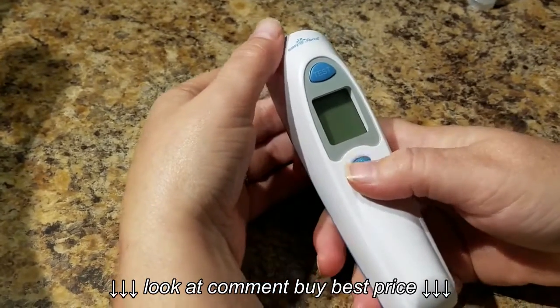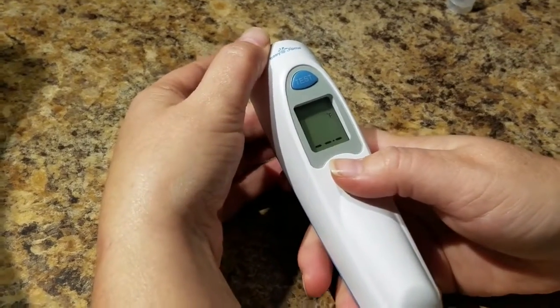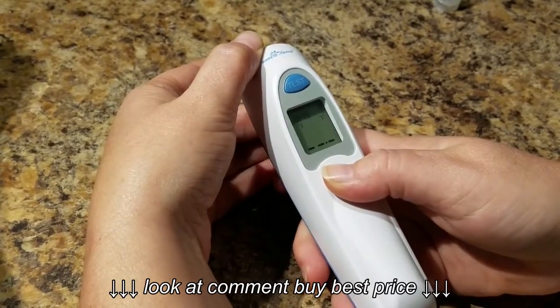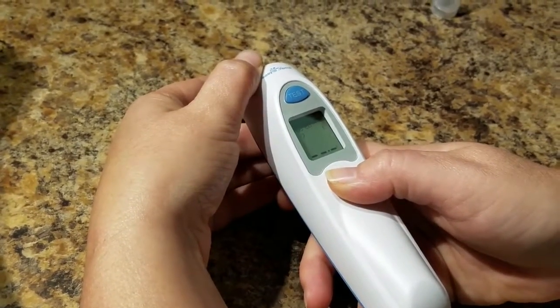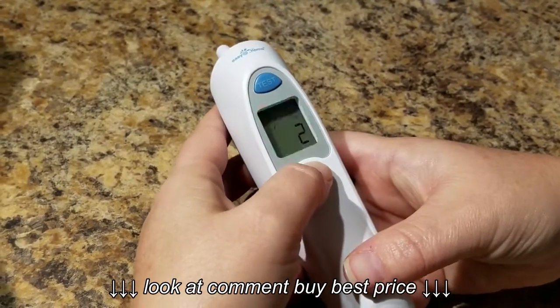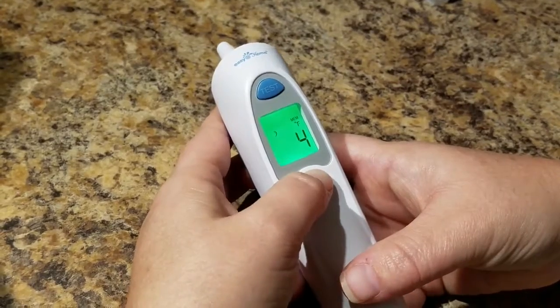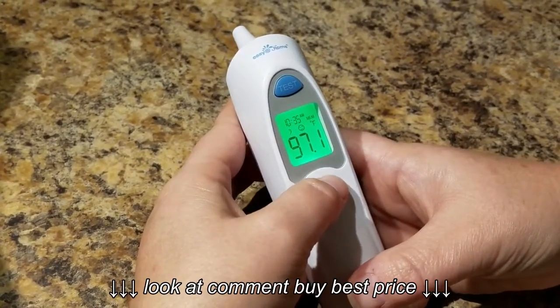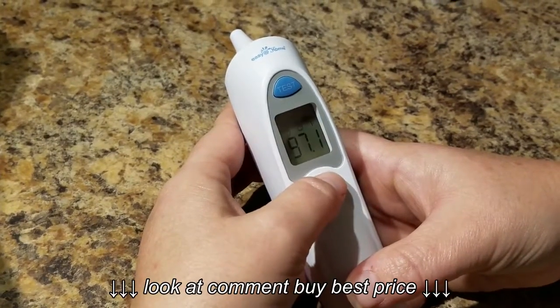Alright, so to use the memory function, you just turn it on. And if you hold down the power button for 3 seconds, you'll get a little memory that pops up. And if you just hit the power button, it's going to go through the last 10 temperatures that it took in chronological order. So your first one is going to be your most recent.